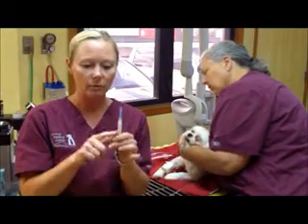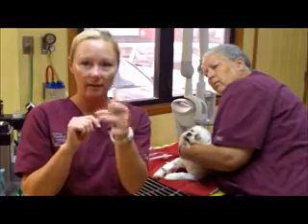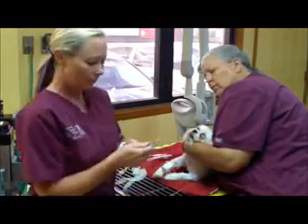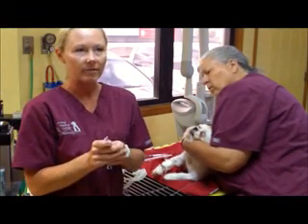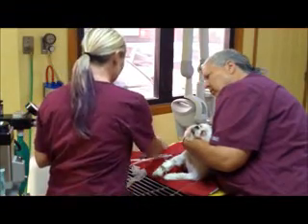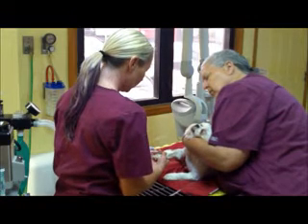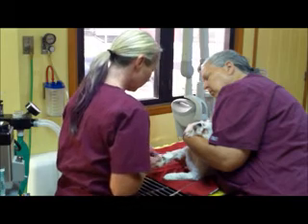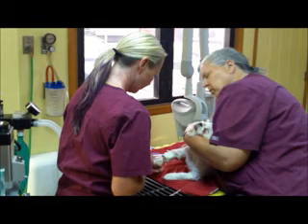We have 3 mils of propofol. There are no air bubbles in it. I have already gotten those out. We are going to flush the patient's catheter, and you want to do that with heparinized saline at 5 units of heparin per mil of saline. Flush it with 2 mils.